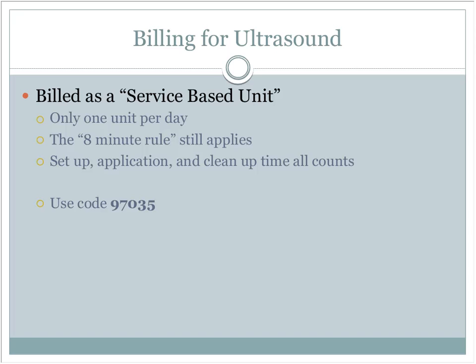Again, think about what it is you're trying to treat and what you are trying to intervene with. If it's a very large area, you may have to do more treatment in order to provide enough energy to the area to achieve the desired results. Ultrasound, very simply, we use the code 97035, okay?